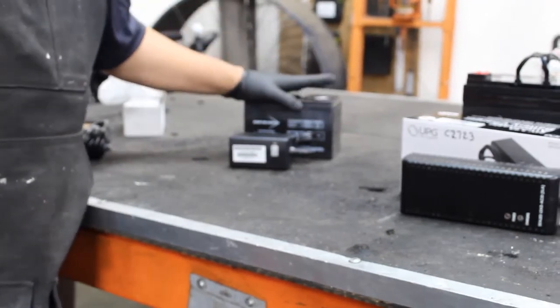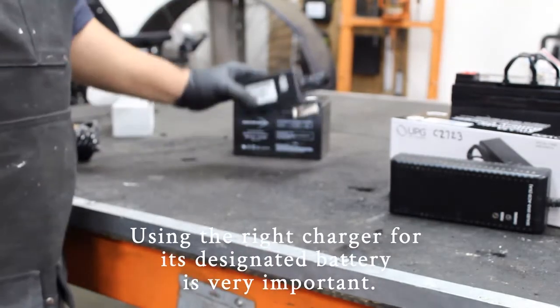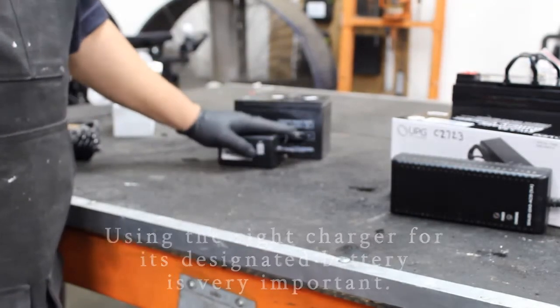If batteries are charged too fast, they will swell up. They will get hot. They could possibly explode. So using the right charger for the right battery is very important.